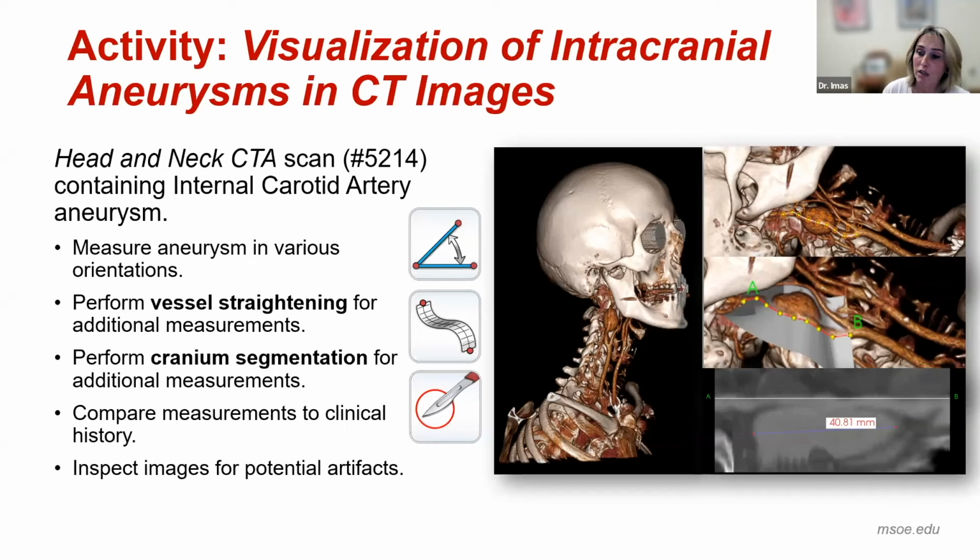But as I said earlier, the case library, Anatomage table in general, allows us to use very, very sophisticated sets of image processing tools quickly. You learn how to use them very quickly, but they're really fairly sophisticated on the back end. It's not something that my students can sit and program in 2 hours, but they can certainly use it in under 2 hours if it's simple enough to learn. So this is an example of a lab project where students get to use some of the very sophisticated standard image processing tools, and they can really look at what it means in the context of real data.